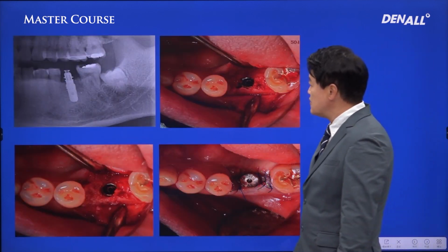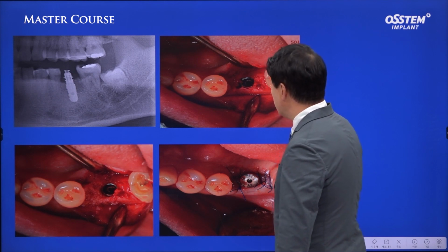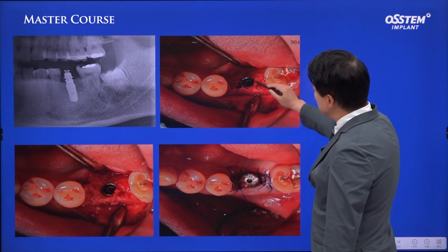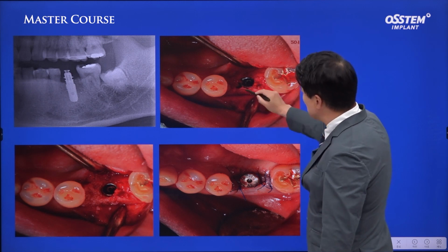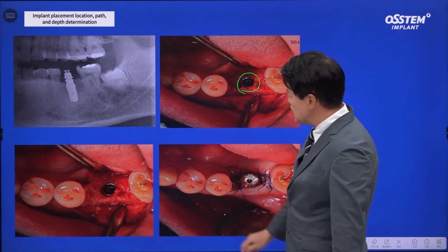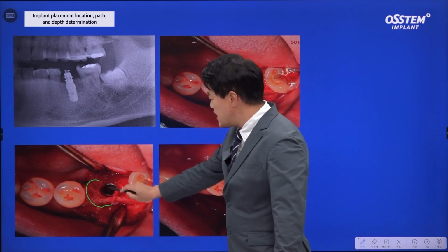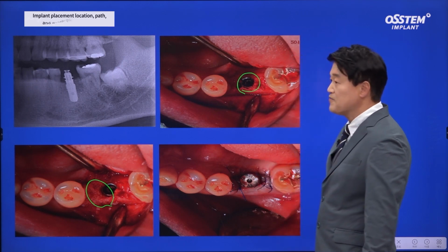So, X-ray. Finally, after removing the mount, using a fixture driver, the implant should be located 0.5 to 1 millimeter below bone, and if there's a gap, GBR is conducted and sutured before finishing the surgery.